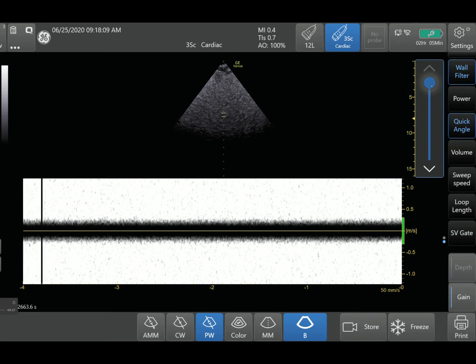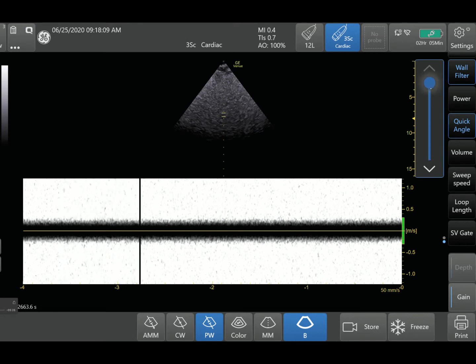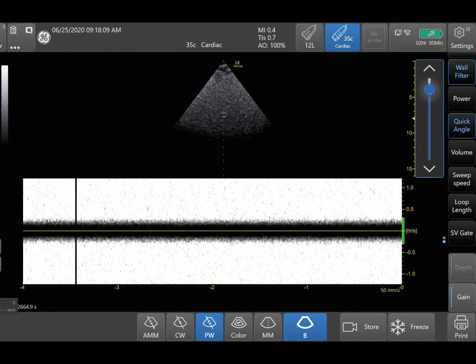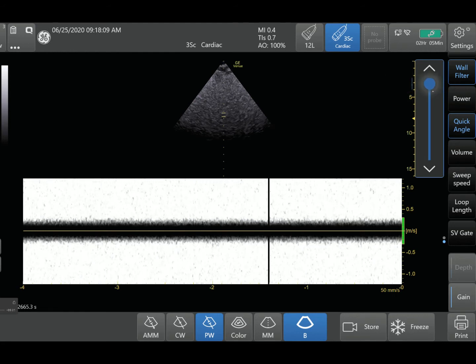The higher you increase your wall filter, the more you're going to filter out lower velocity signals. The lower you put it, the less you're going to be filtering out. So here we're filtering out a lot more low velocity signals. That's wall filter — I hope that makes sense.